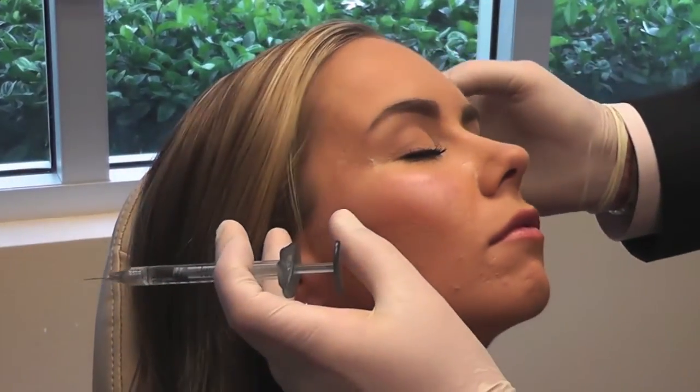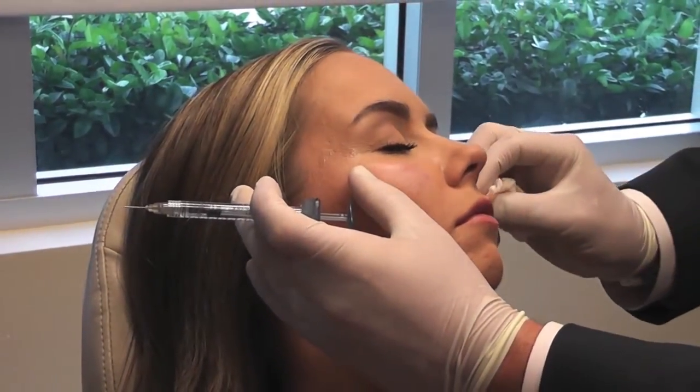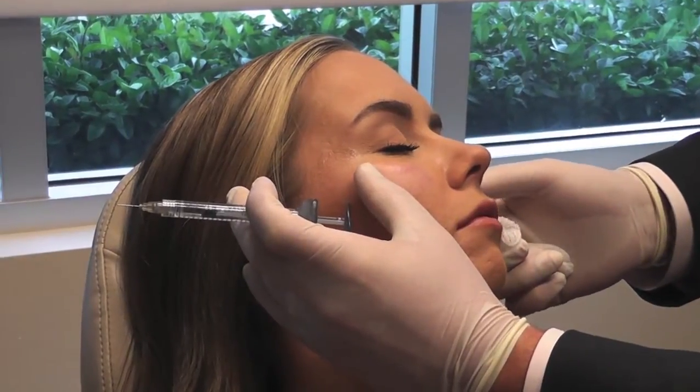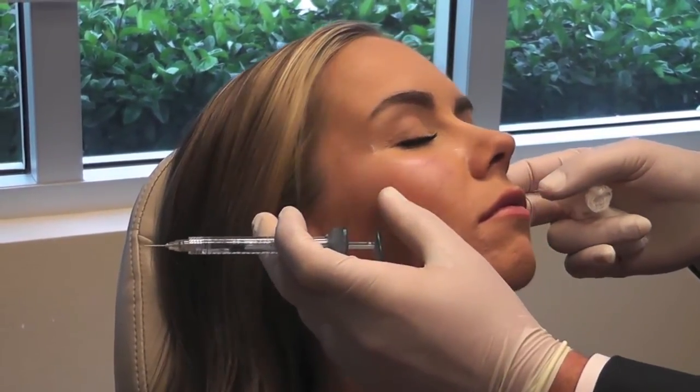All right, turn toward me. Taking your time, going slow, realizing that most patients have at least some recognizable asymmetry that you need to account for when you place the Voluma. Okay, turn away. I'm going to add a little drop right here. Now, what you can see is that augmenting this malar area has created a nice shadow in the submalar area, and this is there.